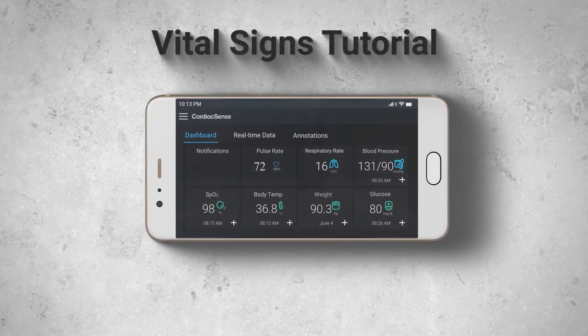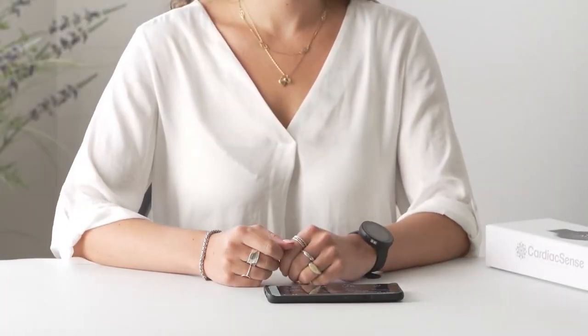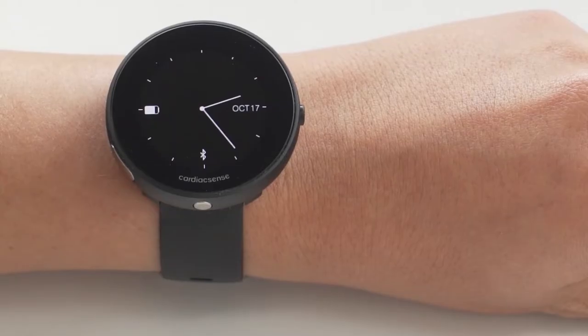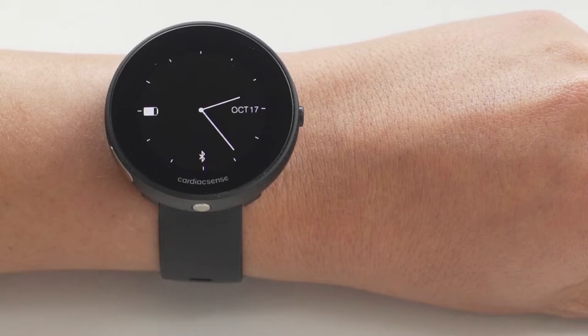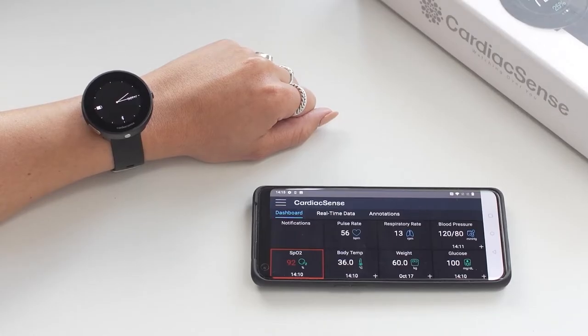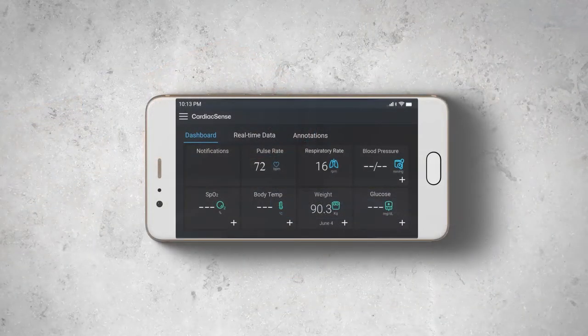Welcome to the Cardiac Sense vital signs dashboard tutorial. From the moment the watch is worn, it continuously measures your pulse rate and respiratory rate. These values are constantly displayed on the mobile app dashboard.